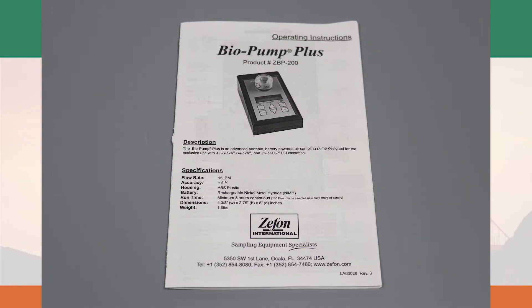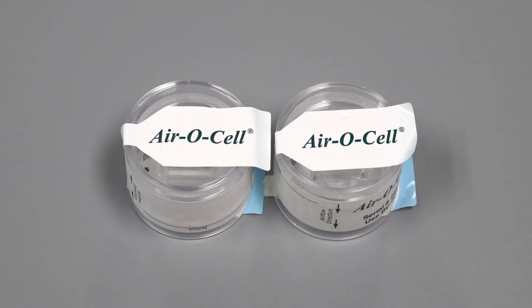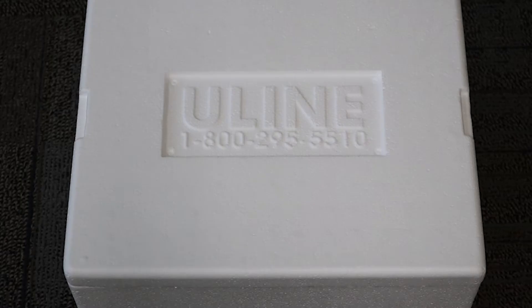Prior to sampling, please read the user manual thoroughly and familiarize yourself with the instructions. Be sure to charge the pump fully prior to sampling. In order to sample, you will need Air-O-Cell or Via-Cell cassettes, which are available for sale at the EmTech online store. You may also need additional materials such as Ziploc bags, Sharpies, disposable gloves, and a box for shipping.